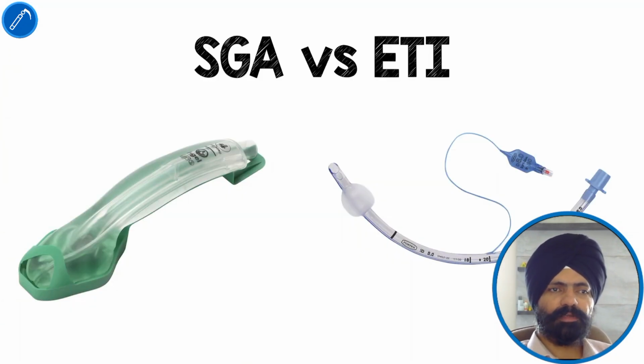Coming on to the differences between iGel and endotracheal intubation. In endotracheal intubation, we intubate the patient with an endotracheal tube and then we inflate the cuff of the endotracheal tube. So naturally it prevents aspiration. It is a secure airway and it can be used for long surgeries. But if the duration of the surgery is short, then we can use iGel in place of an endotracheal tube, because it prevents the tracheal irritation which an endotracheal tube can cause. It automatically fits in the laryngeal area, so it is very easy to insert.